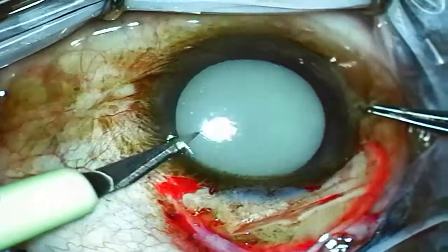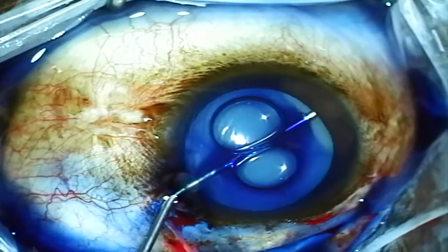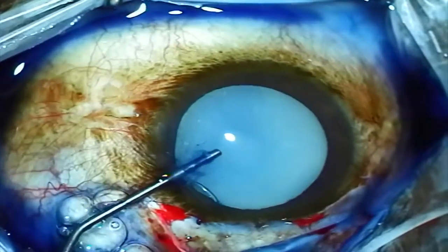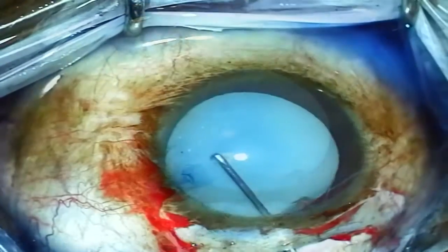A paracentesis port is created and then vision blue is used to stain the anterior lens capsule. Next, viscoelastic is used to remove the vision blue from the anterior chamber. Then a keratome blade is used to enter the anterior chamber via that superior scleral tunnel that was created earlier.